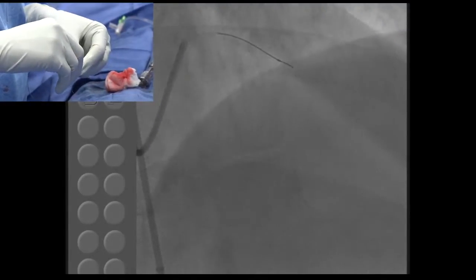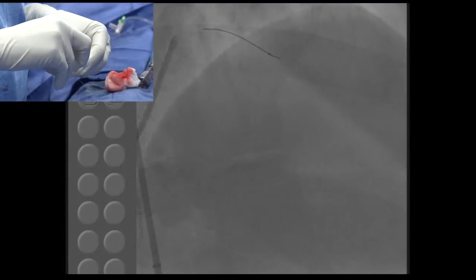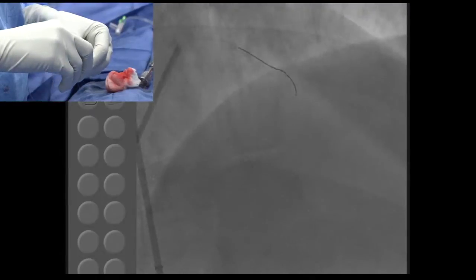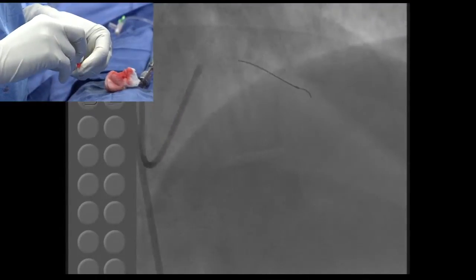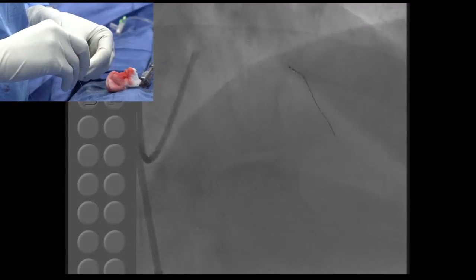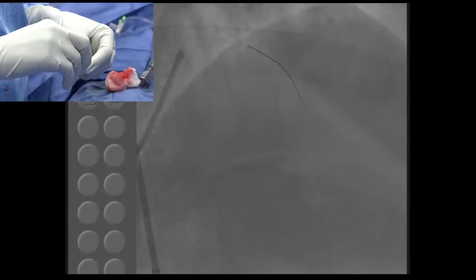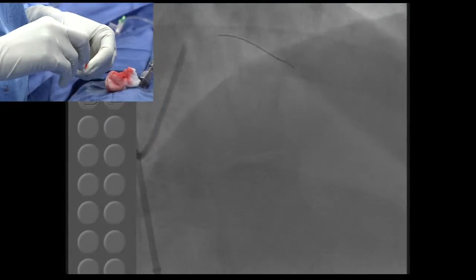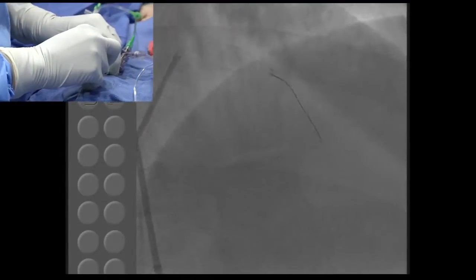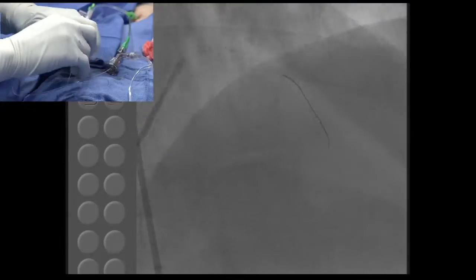But anytime you have two CTOs in a young patient, you always talk about what is the best approach, should you go for surgery and get those two bypasses done. But clearly we felt that we have a good chance of success of the CTO recanalization in this particular case, so despite little brisk collaterals of the right coronary, Anu was able to succeed that time, so it's reasonable that we selected this approach. Okay, let's take an angiogram and see.